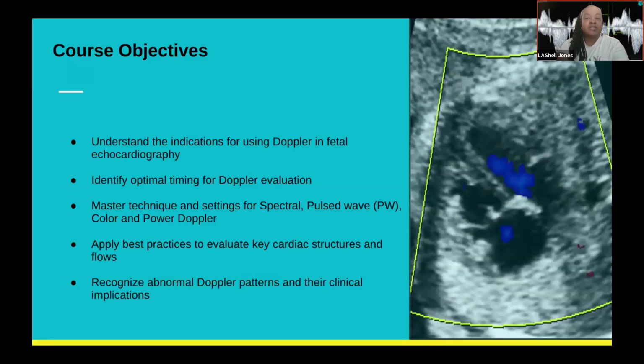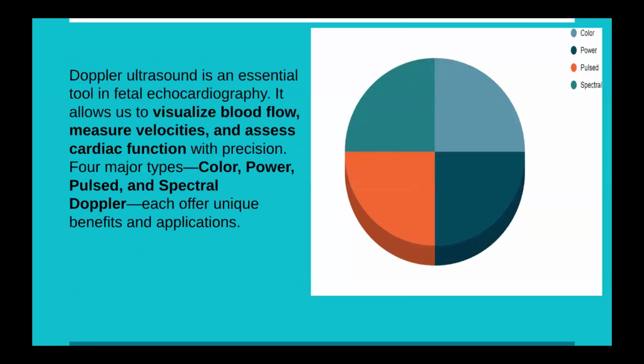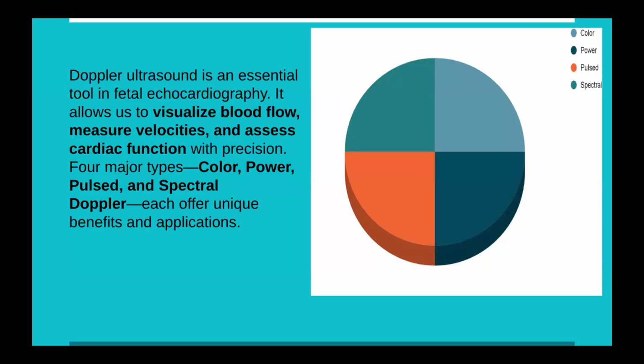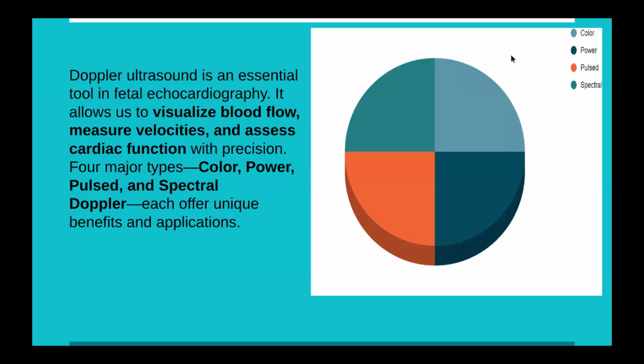Okay, so let's get started. Now, first and foremost, Doppler ultrasound is, I feel, a very important and essential tool in our fetal heart assessments.